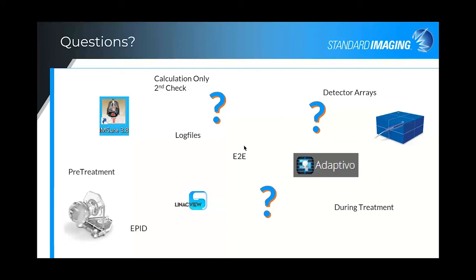And then, of course, the 3D adaptive is a whole different module that gives you an indication of the 3D volumes and the changes to those volumes throughout patient delivery based on the daily cone beam CTs. So that's I guess a much different and much more detailed view. But with the 2D, they're complementary, and then with the 3D, it's an independent adaptive view.